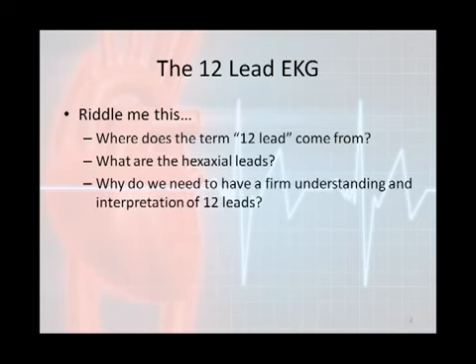Why do we need to have a firm understanding of interpretation of 12 leads? Well, I have three separate reasons why I've actually come up with. Number one, advancing in treatments. With the advancement of research and technology, we have a better understanding of the pathophysiology of myocardial ischemia and infarction.